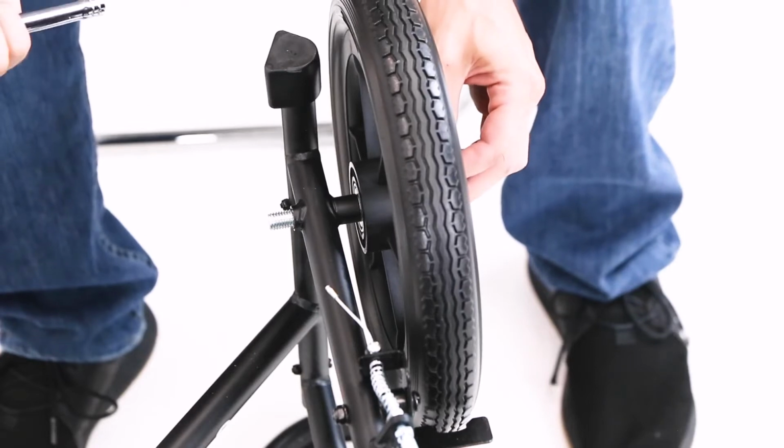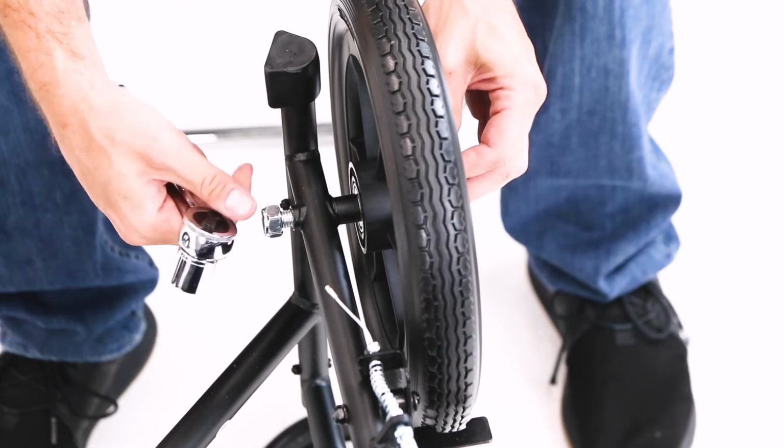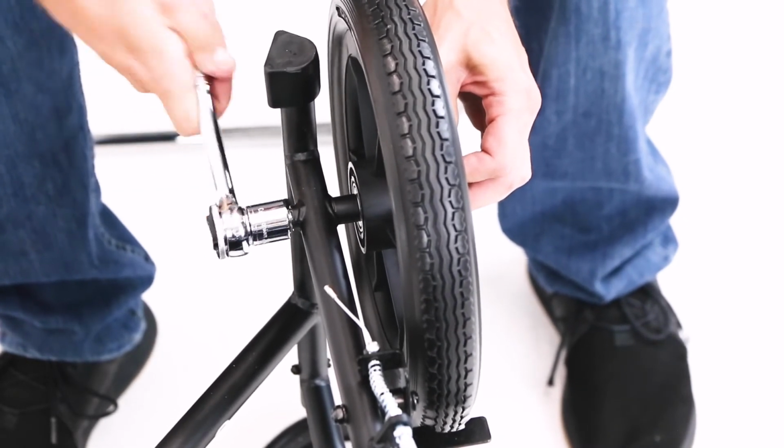All right, and then the final step will just be to place your bolt back on and make sure it is nice and tight. And that'll do it.